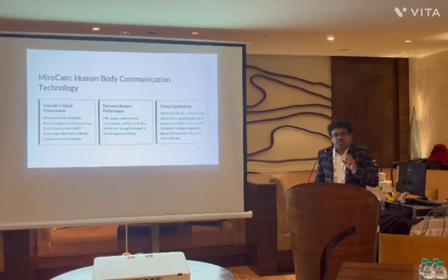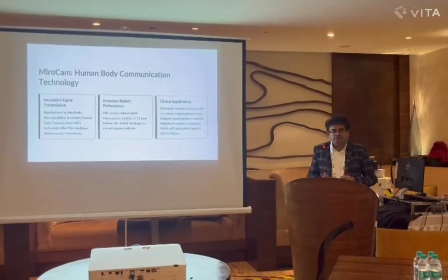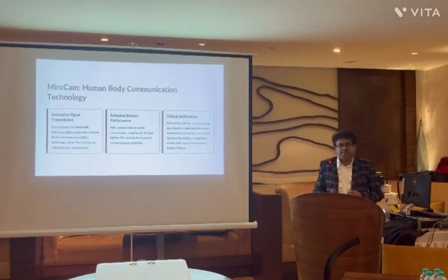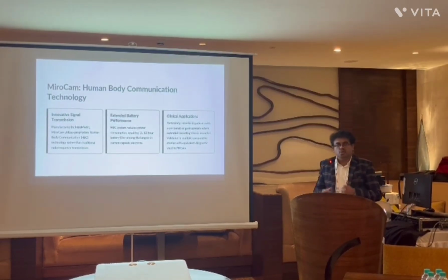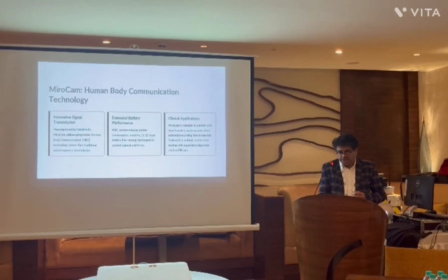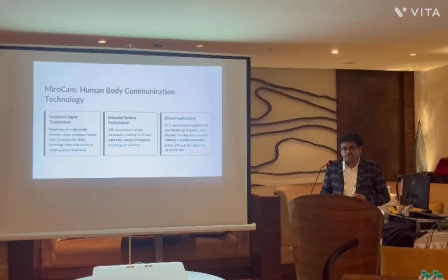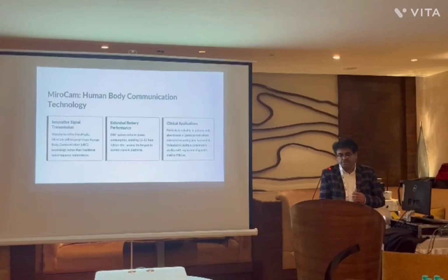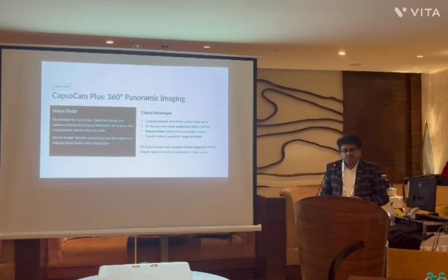MiroCam is a newer innovation in signaling. Rather than radio frequency, human body communication is applied when you use the MiroCam, and extended battery performance is available. The MiroCam, PillCam and OMOM devices are all mainly aimed at diagnosing small bowel lesions. For MiroCam, the main intention is when your patient has slow transit events or gastroparesis, where we need a more validated, longer recording time. Capsule cam has already been discussed: a panoramic view of almost 360 degrees.